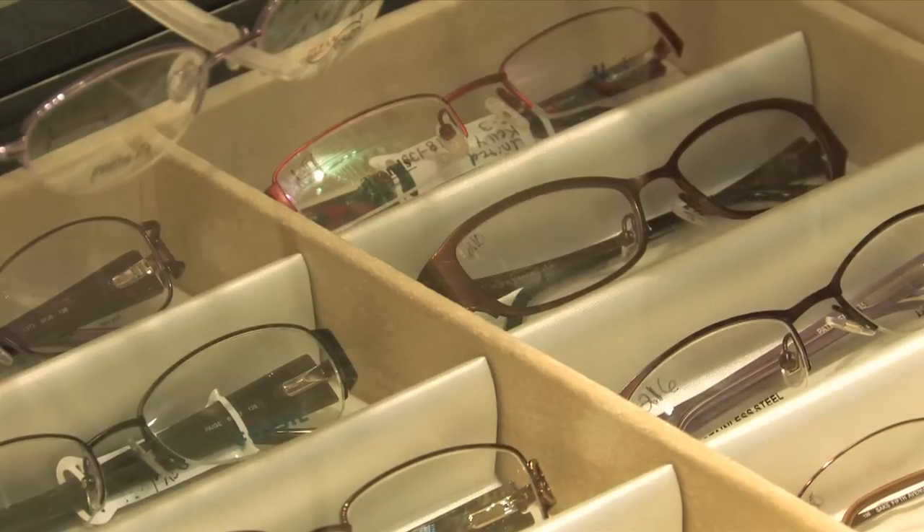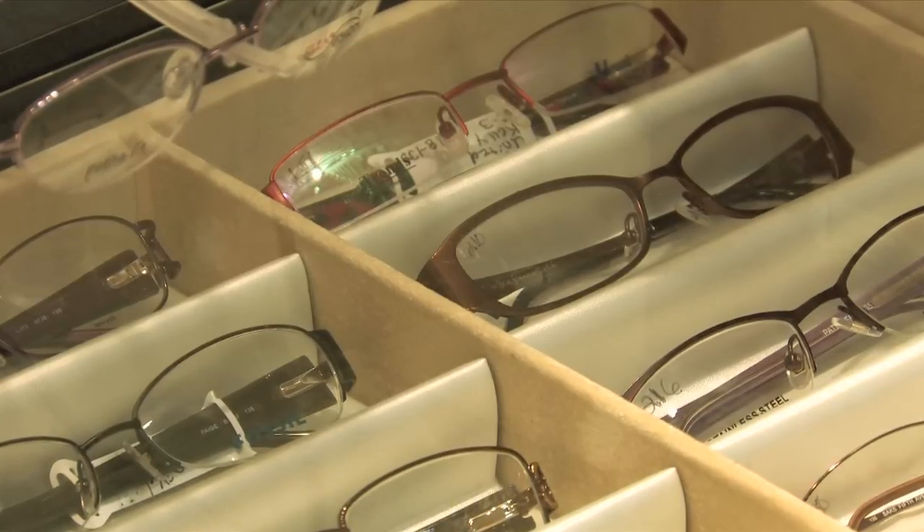Hi, I'm Amy Klaus. I'm an optician at Blue Ridge Optical in Roanoke, Virginia, and today I want to show you how you can tell the difference between a polycarbonate lens material and a glass lens material.